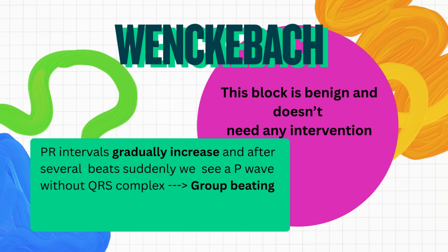But the problem is that sometimes the PR intervals are gradually increasing, and after several beats, suddenly we see a P wave without a QRS complex, which makes Wenckebach. And in Wenckebach, we see group beating.